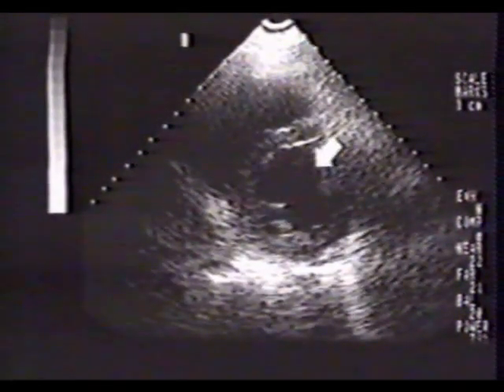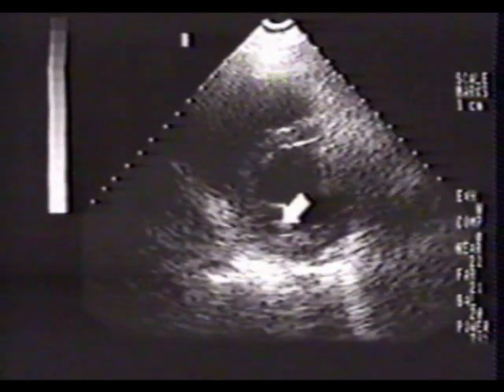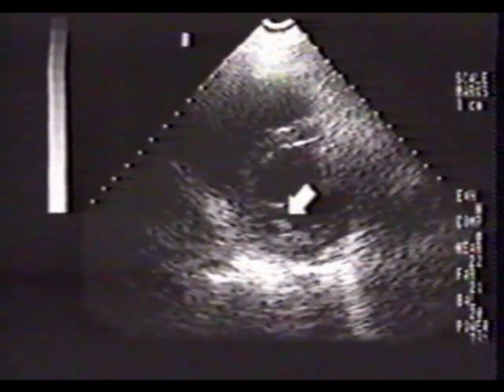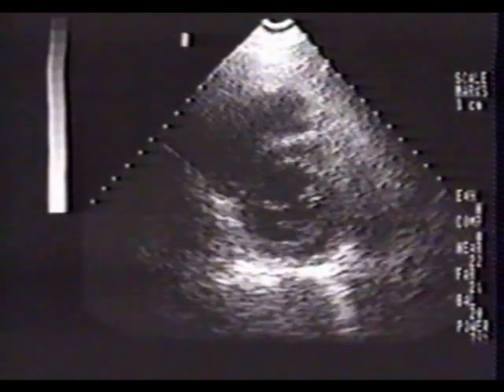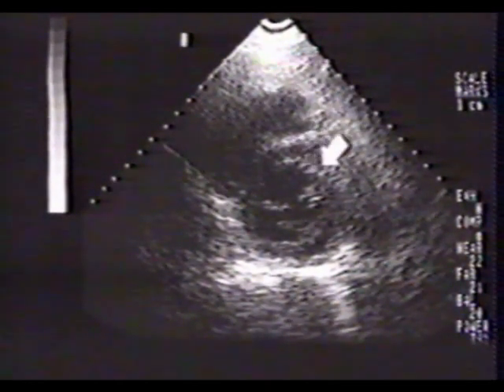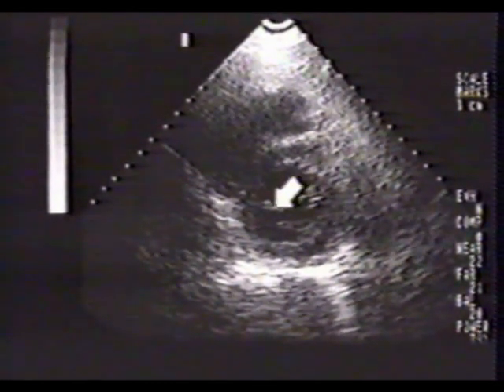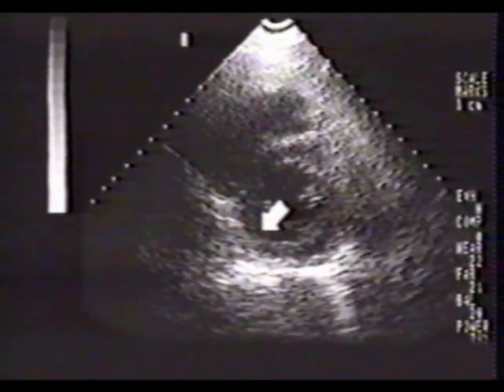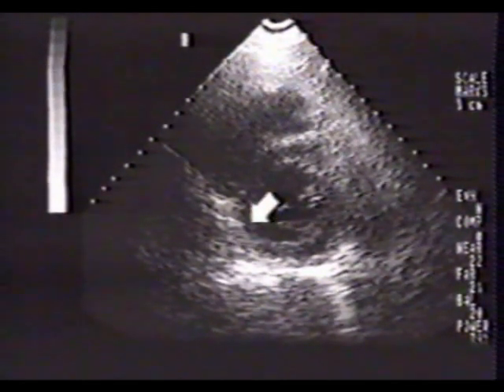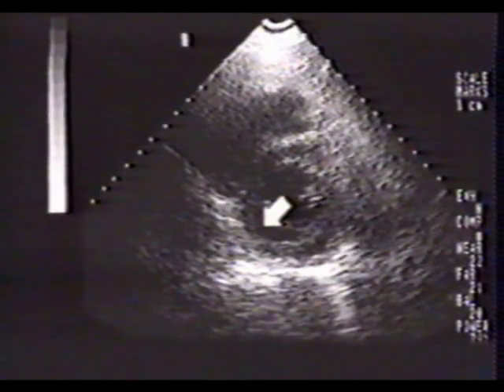This is a parasternal short-axis view of the left ventricle. This is the inferior wall and overlying posteromedial papillary muscle. In systole, the septum and anterior wall have thickened. The transducer has been tilted slightly to separate the papillary muscle from the underlying inferior wall segment. The inferior wall is thinner in systole than it was in diastole. This dyskinesis will be more apparent in real time.